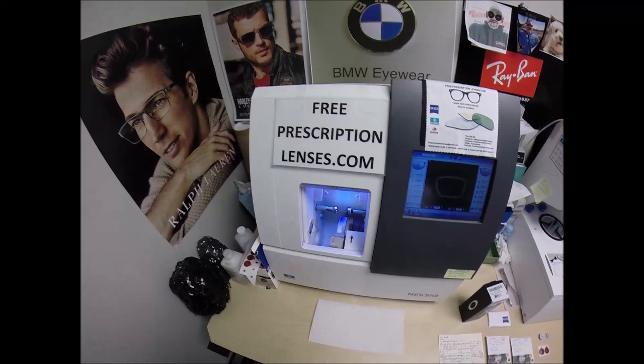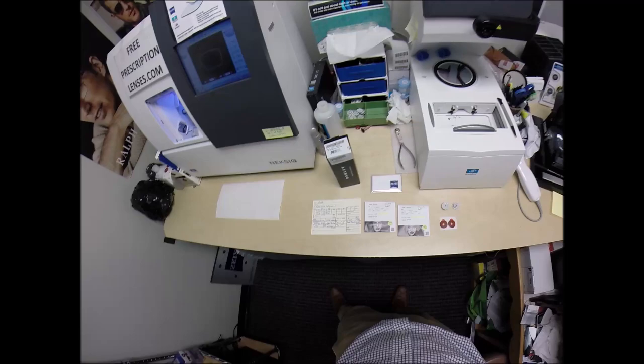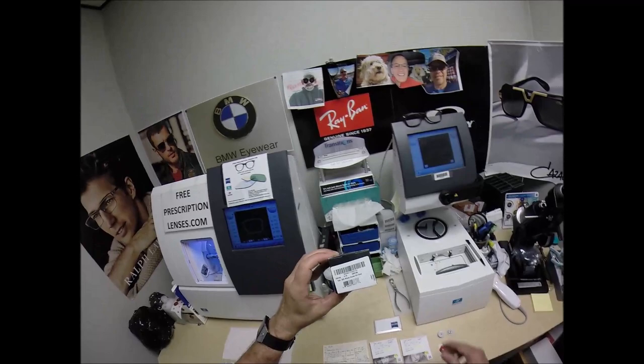Rod in Redwood City, California — see more better with freeprescriptionlenses.com. Call me Moe, Moe Better, because I'm going to have you seeing Moe Better, looking Moe Better, and show everyone else how I bring that loving feeling back to glasses when I cut the Zeiss Photofusion Extra Gray lenses with the Gold Flash Mirror for your Oakley 8166 Wheelhouse, size 52, color 02, in the polished clear.